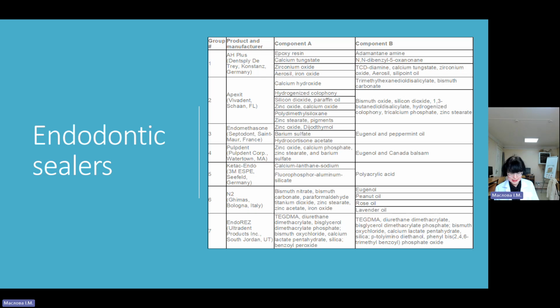The first glass ionomer cement sealer set too rapidly to allow the use of the lateral condensation filling technique. For endodontic application, radiopacifiers were required, and modifications had to be made to the powder to increase its setting time. Prototype materials had similar leakage to Ketac-Endo sealer.